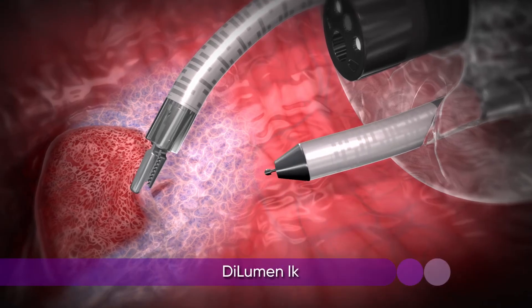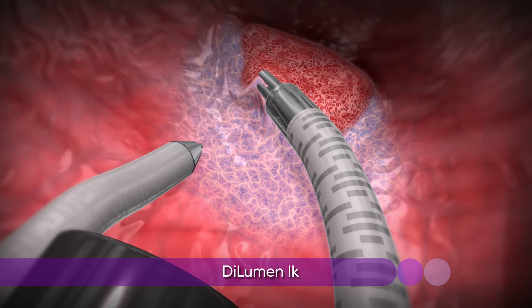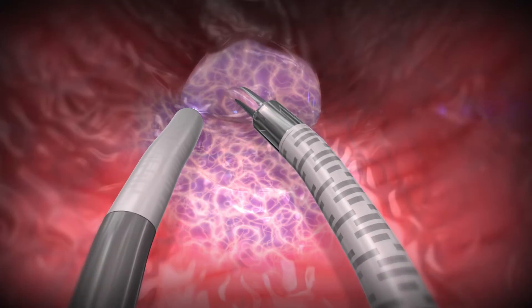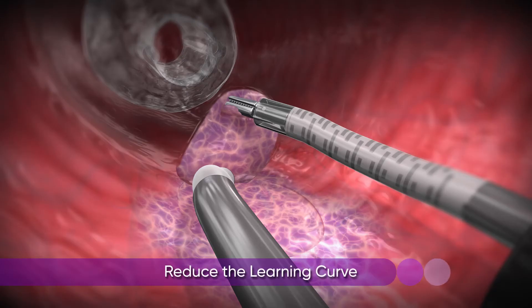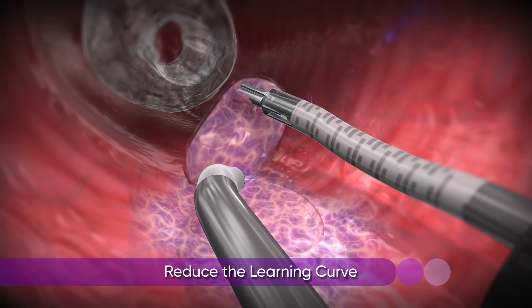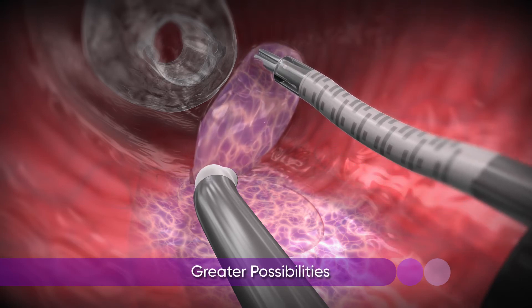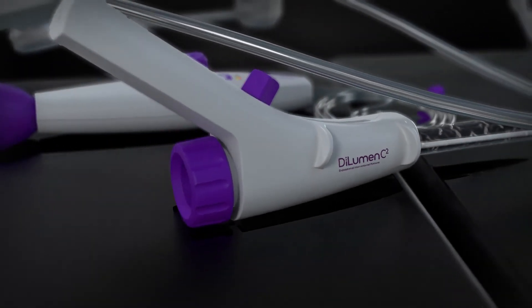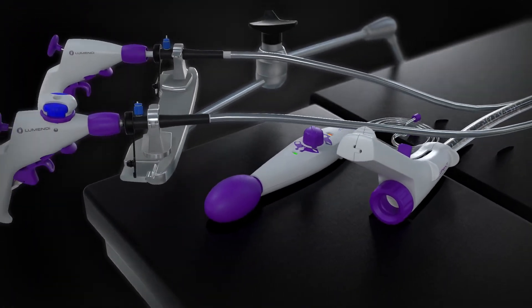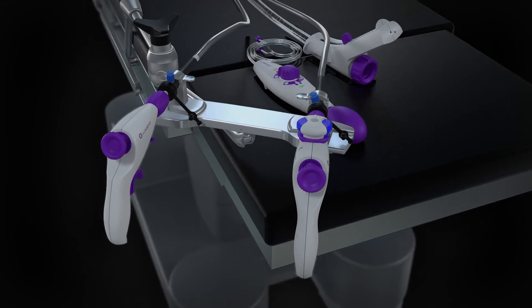The DiLumen IK provides precise and effective dissection of mucosal tissue. These new tools, along with standard endotherapy devices delivered through the endoscope's working channel, may reduce the learning curve for complicated endoluminal procedures and offer greater possibilities to treat diseases of the colon in a more controlled and precise way. Lumendi is proud to lead the way in developing the devices that will result in shorter procedures, faster recovery times, and lower costs to the healthcare system.